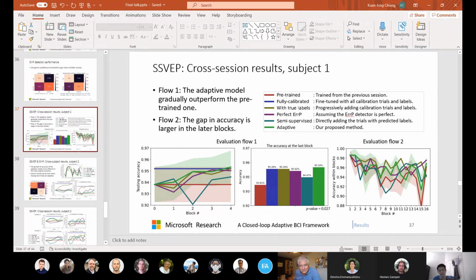Yeah, also I think a good design, if you're continually swapping users, is probably to use disposable electrodes, because I think people will feel uncomfortable using electrodes that have already been used by many subjects.